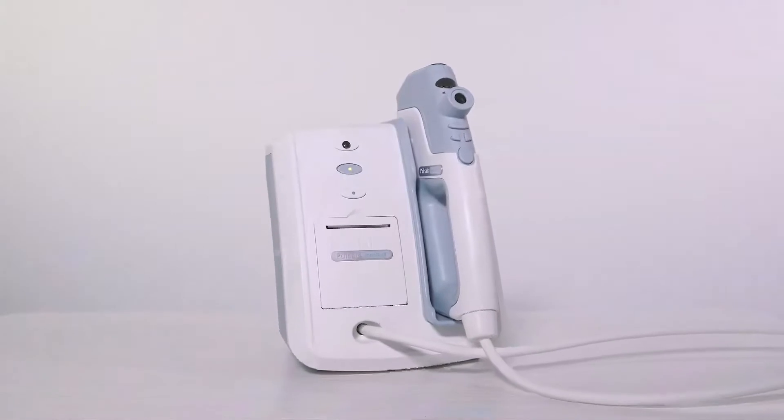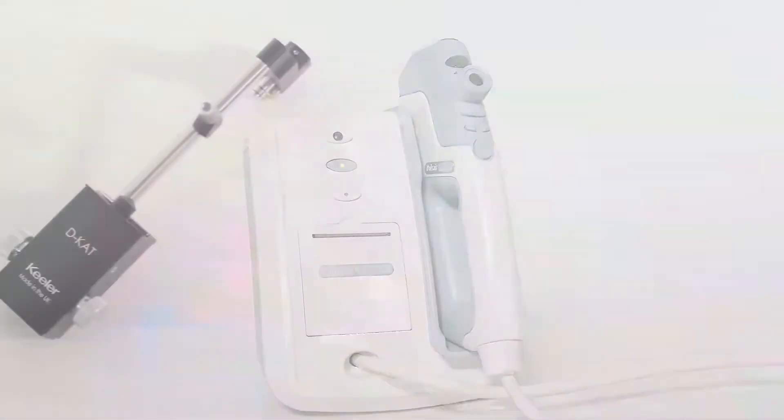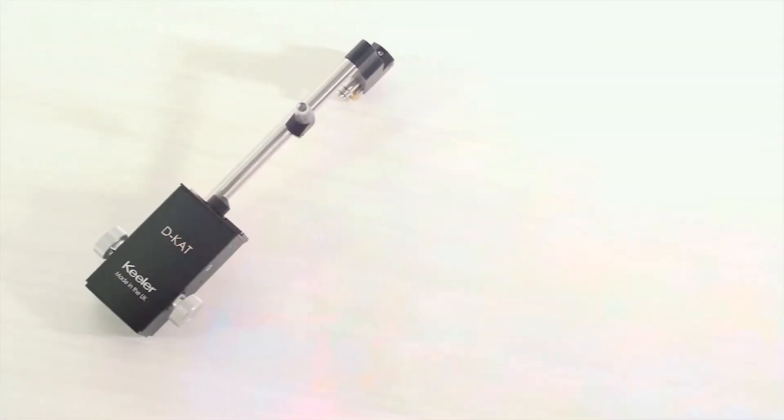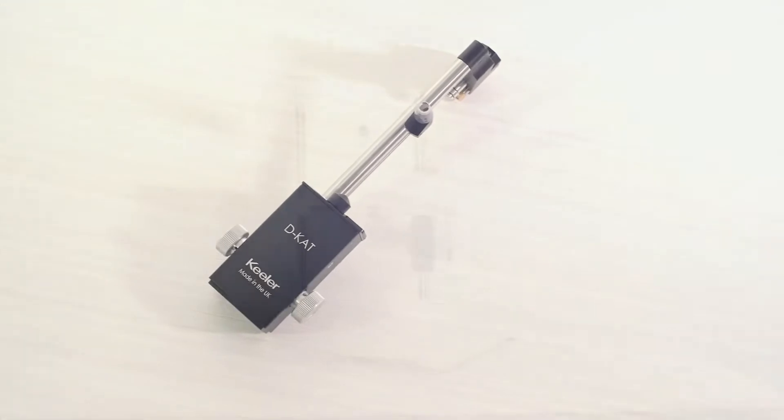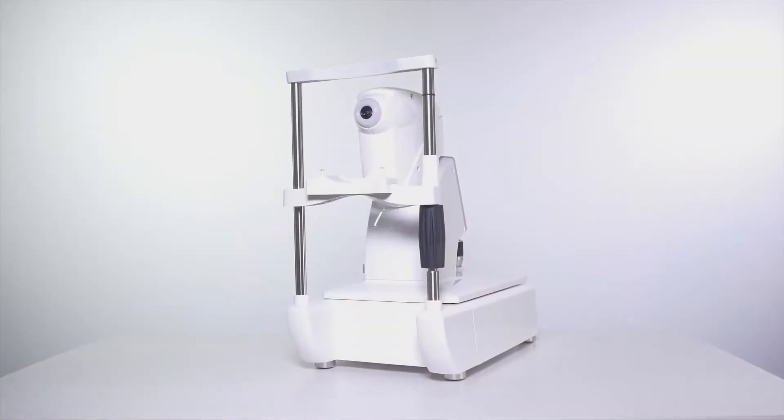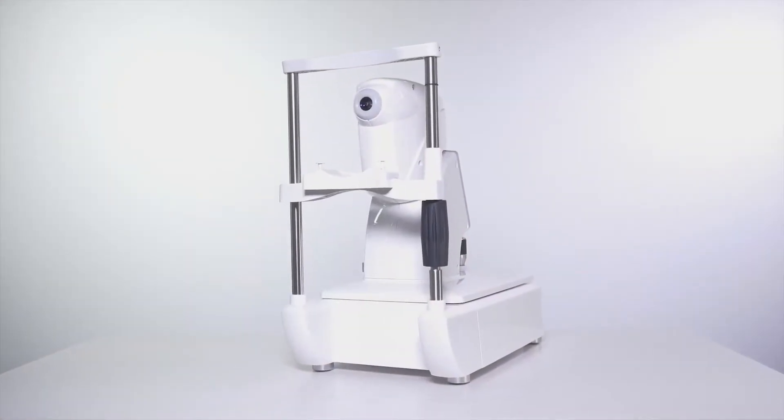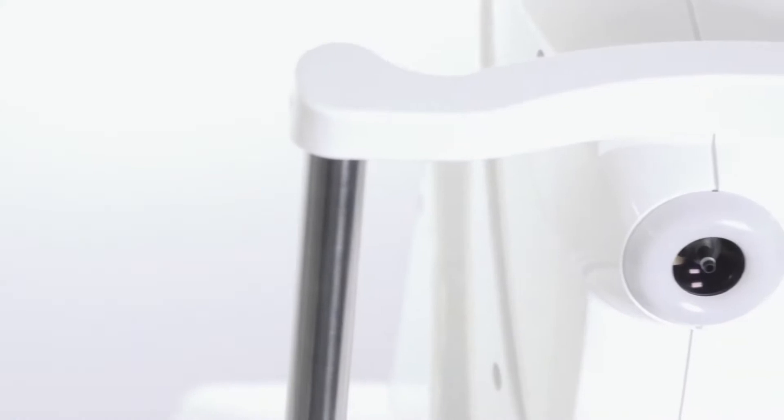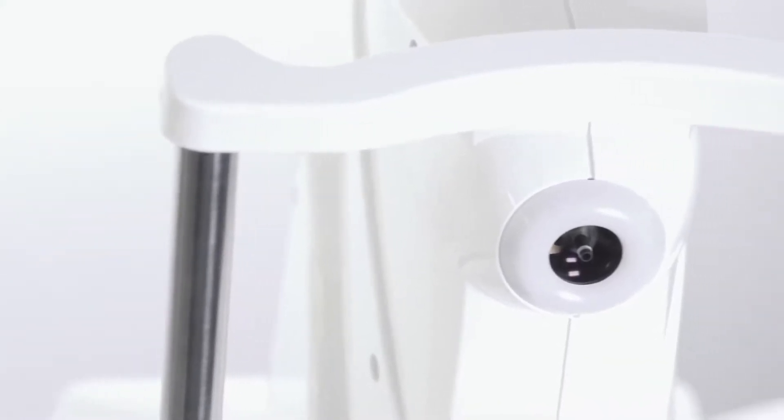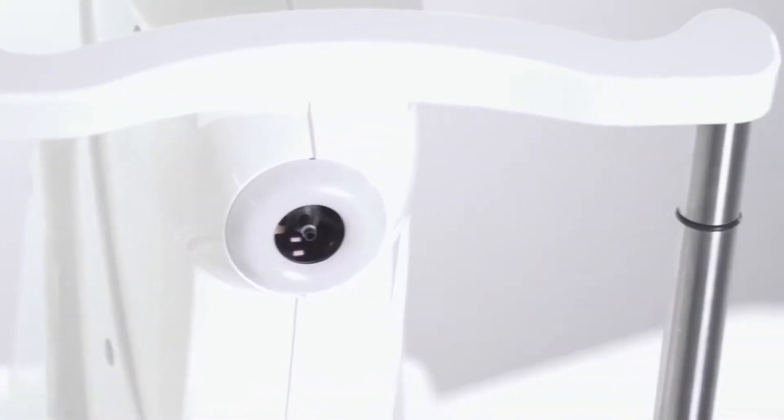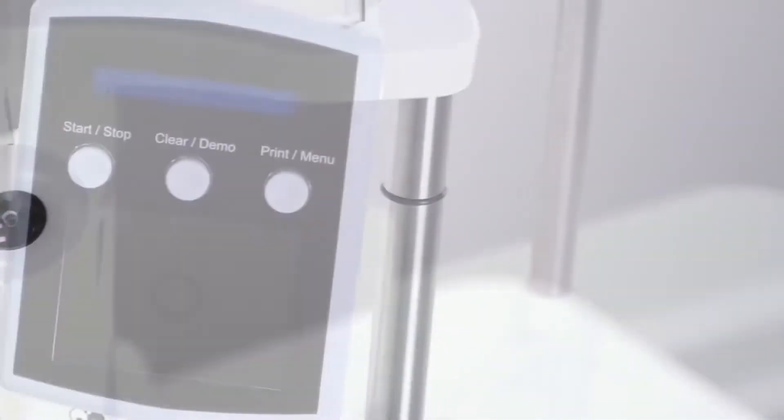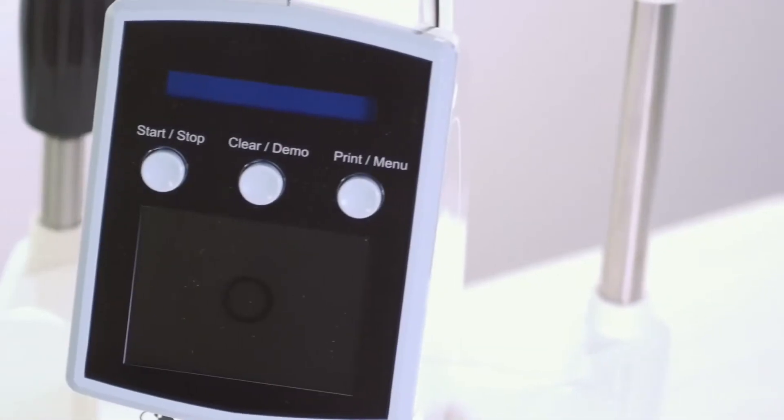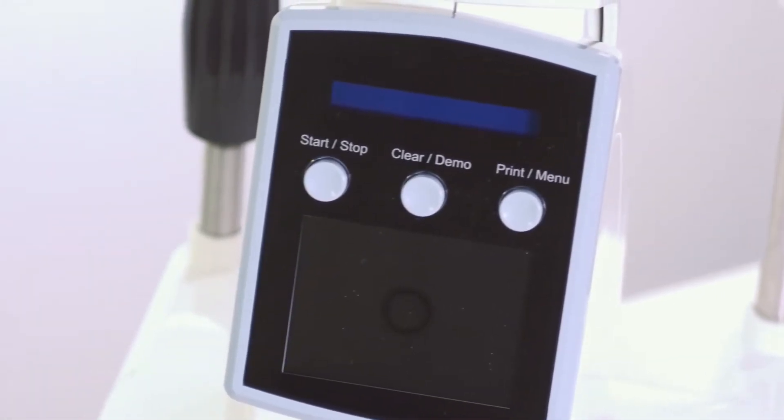Keeler offers a line of tonometers, both non-contact and contact, that deliver consistent and accurate readings. The Keeler PulseAir desktop has been designed with you and your patients in mind. Its slim profile reduces patient anxiety and allows you to keep visual contact throughout the exam.